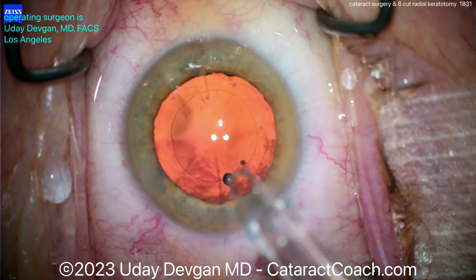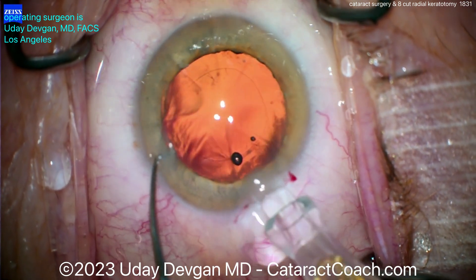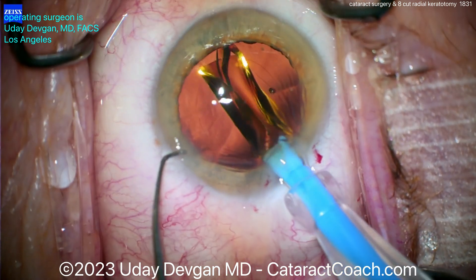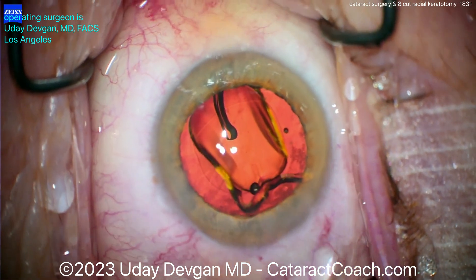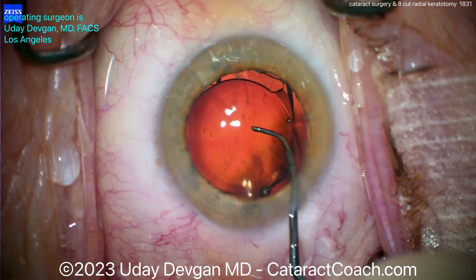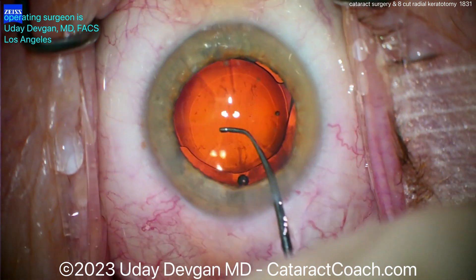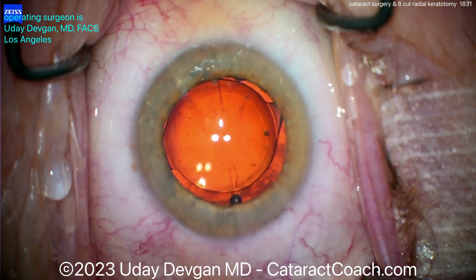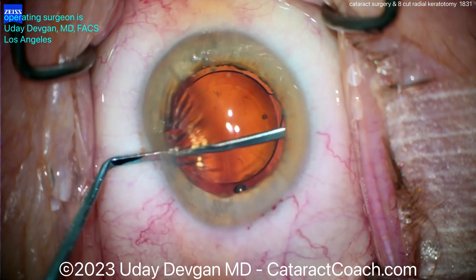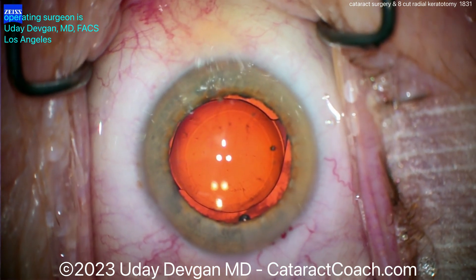Here comes the lens. Be cautious as you insert it — you don't want to put pressure on the existing RK incisions. As we insert this lens, look how the eye is underinflated. Nice and gentle to get that lens in. You don't want a highly pressurized eye; you don't want stress on those RK incisions. Here's the lens getting into the capsule bag, nicely centered — you can see it's a good rhexis, just about a perfect 5mm rhexis. A little more polishing on the capsule bag with the spatula, and that cleans up pretty nicely.